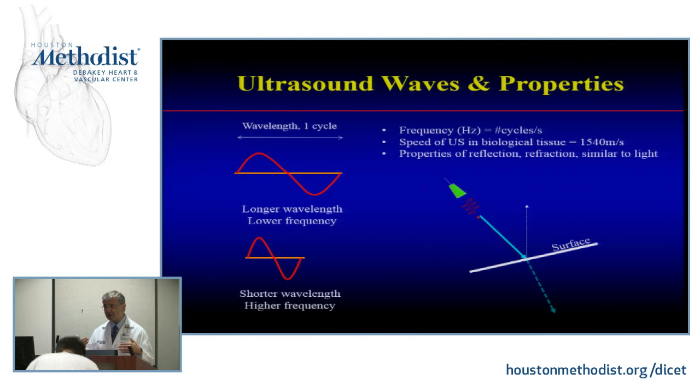If you want to get a maximum of that emission, you have to be perpendicular to the structure, and we know the structures are not linear, right? So you have to be perpendicular to the structure, so that little arrow of white that is going back out is actually merging with your red arrow coming back to the transducer. Okay? So I'm going to talk a little bit about how this works.